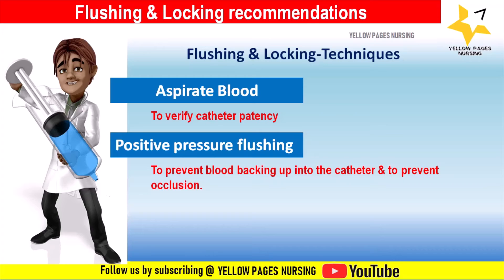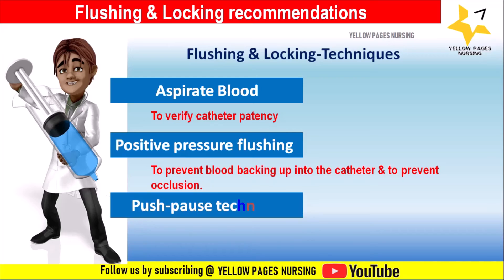Another technique involves clamping the catheter while injecting the last 0.5 ml. Positive pressure flushing prevents blood from backing up into the catheter by keeping pressure on the syringe plunger while pulling out of the injection cap. Do not completely empty your syringe during a flush.